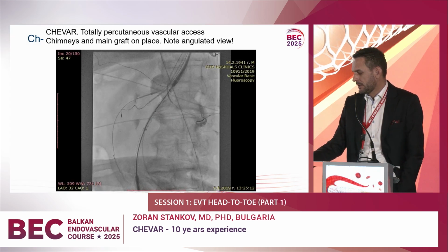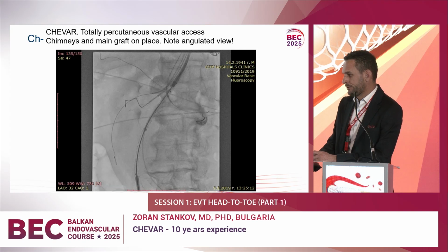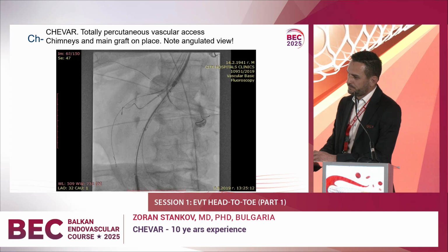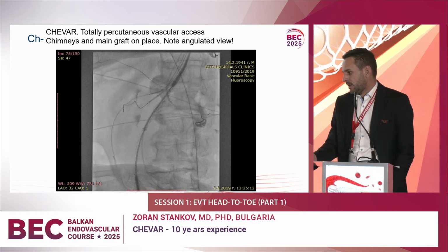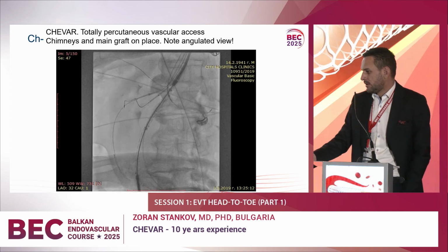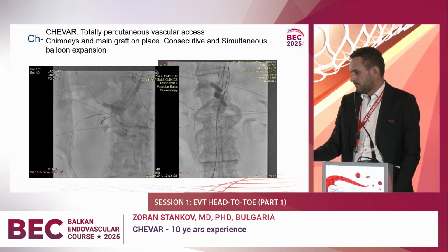We see the cannulation. This is the most important part of the procedure, the placement of the stent grafts in the side branch. Precise, everything to be on the one line, to prevent the occlusion of some of the side branch.